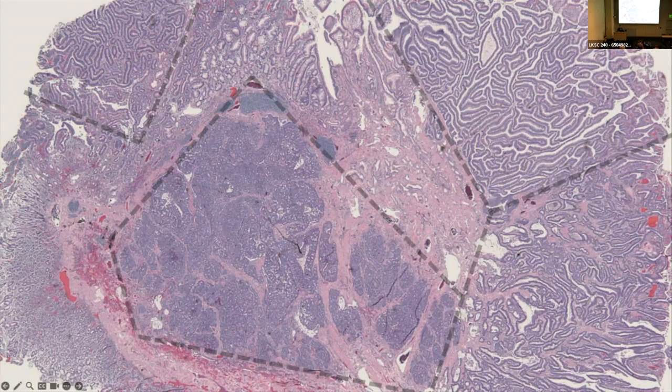And there are a lot of crappy antibody clones out there that just do things you don't expect, like Ki-67 in the neutrophils, which is something you seem to see a lot, but neutrophils are not supposed to be mitotically active. So things that just don't make sense. I think this is where your pathologist can really help, with your positive and negative controls to act as your QC.